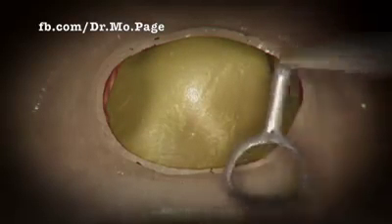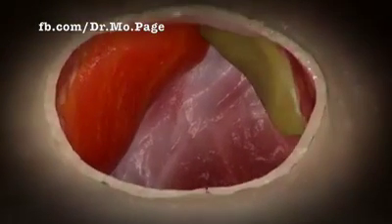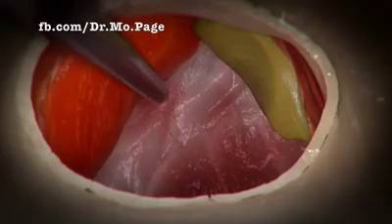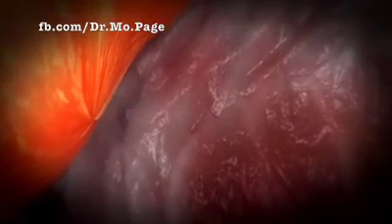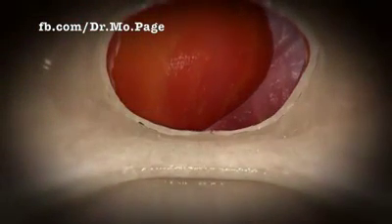For large tumors such as the one shown here, the lower portion is removed first using microinstruments and suction. The remaining tumor is separated from the surrounding normal structures, most importantly the compressed pituitary gland, to help preserve or restore its function. The entire cavity, including the walls of the cavernous sinus, is then carefully explored with angled endoscopes to make certain that all safely accessible tumor has been removed.